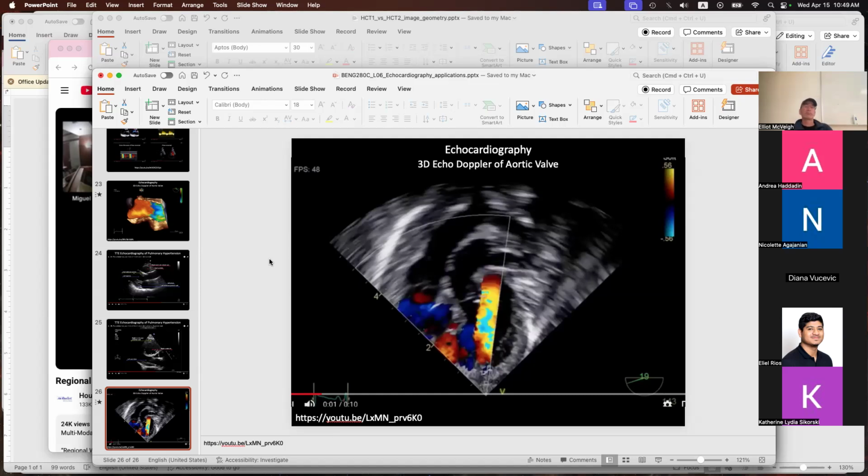A cardiac MRI exam, as we'll see, takes about an hour, right? Echo probably takes about a half hour. Then a physician has to read it. It takes the physician probably 10, 20 minutes to read it, maybe 10. So they can only do 6 readouts an hour, so those are all expenses that add up. So it's not cheap.